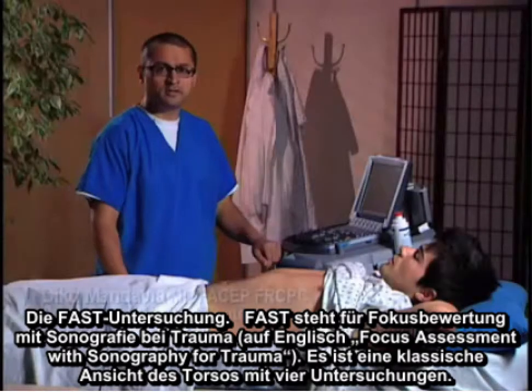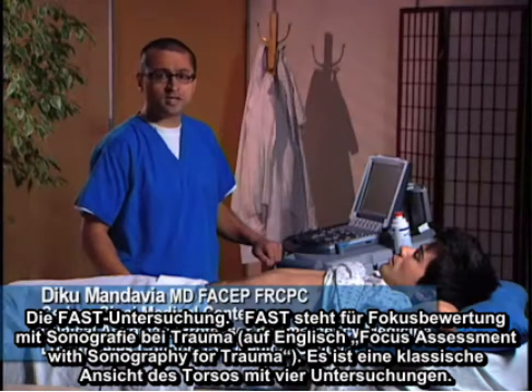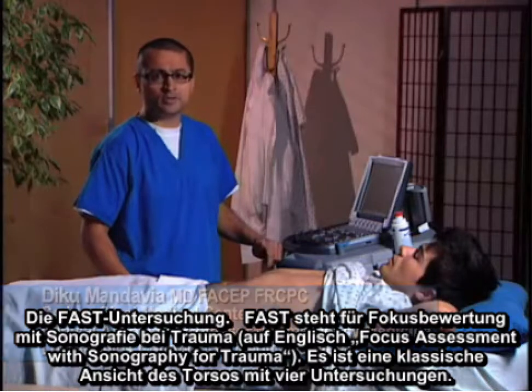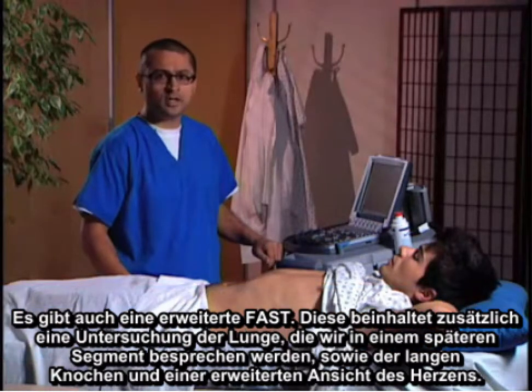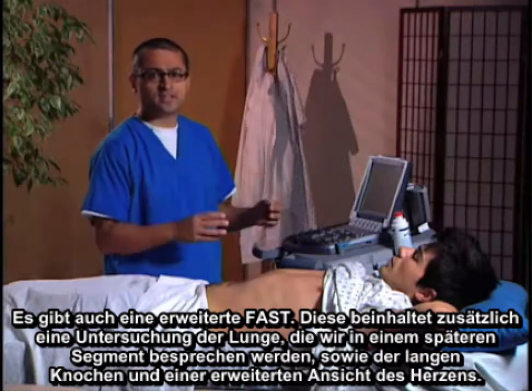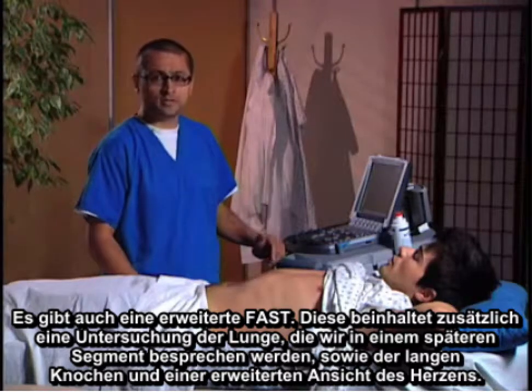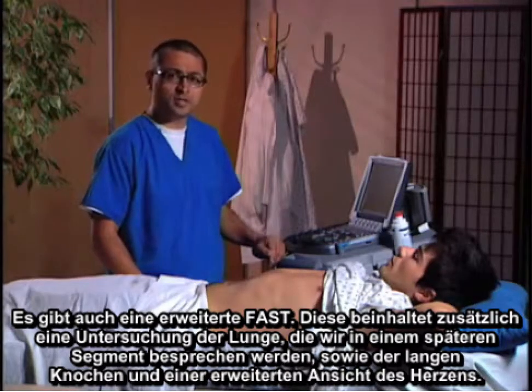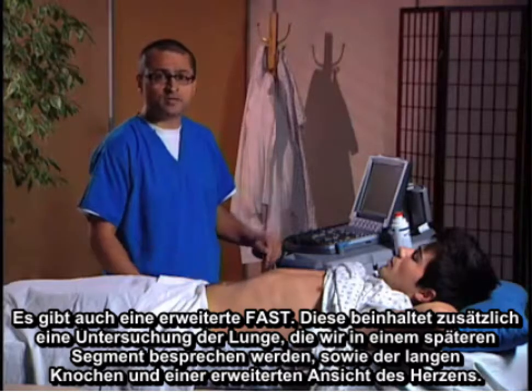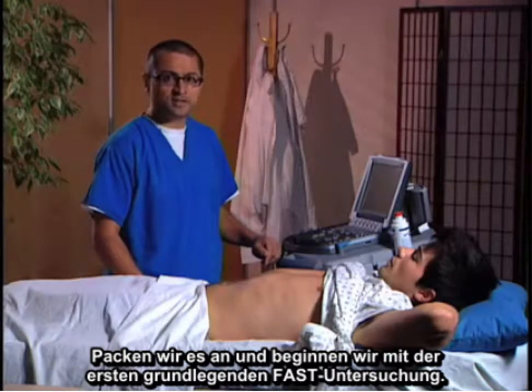The FAST exam stands for Focus Assessment with Sonography for Trauma. It's a classic four-view exam of the torso. There's also an extended FAST that includes further examination of the lung, which we'll cover in a later segment, as well as long bones and expanded views of the heart. Let's go ahead and start with the basic FAST exam.